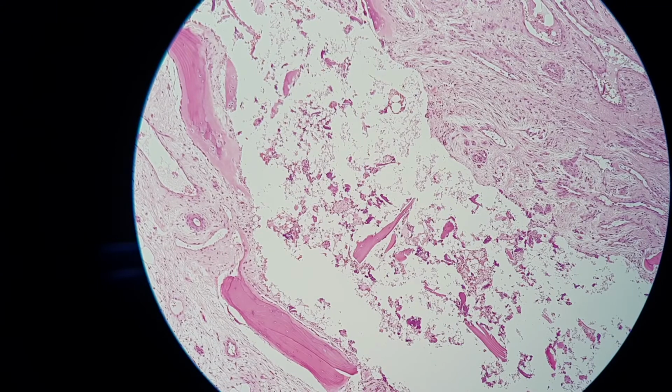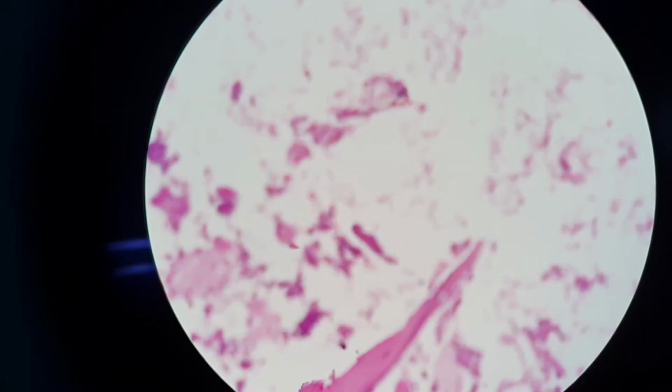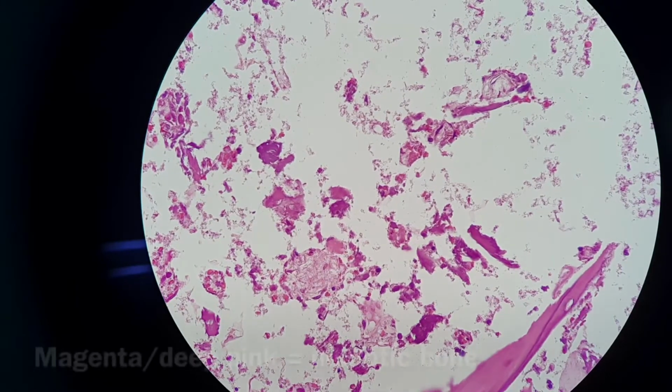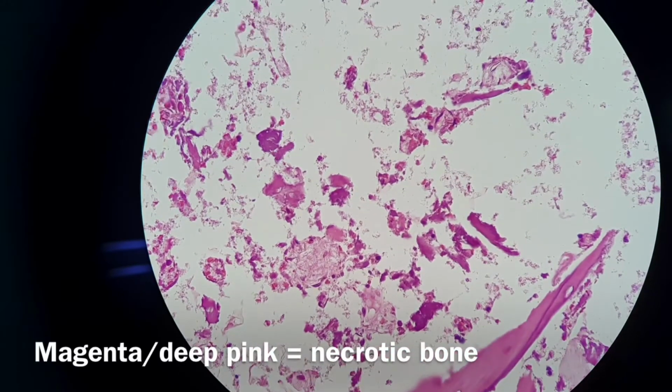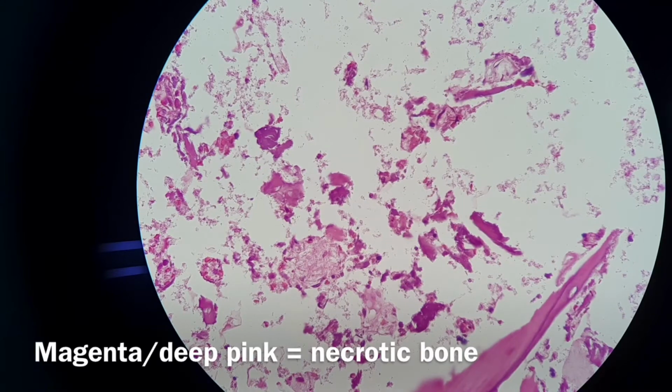Here you can see some bony trabeculae have been fragmented, something must have been causing this. At higher magnification, you can see there are also necrotic bony trabeculae. The necrotic one is the one with a deep pink, or sometimes magenta-like color. So that is the necrotic bone.